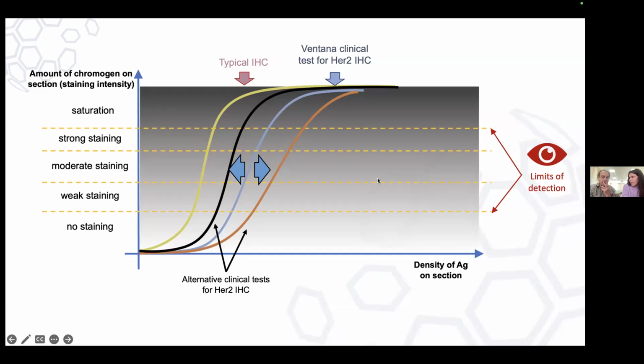But this is interesting because this also relates a lot to the perceptible intensity of staining. Between positive or amplified, positive overexpressed or negative, usually when HER2 is overexpressed, it is diffusely overexpressed, especially in breast cancer. But now we rely a lot on proportion of tumor cell staining, and you wonder whether the pathway of testing should also be altered in a way of testing multiple samples. So this is the limitation of continuing to use a test that was designed for something else, and adapt it to use it for this low-level expression.